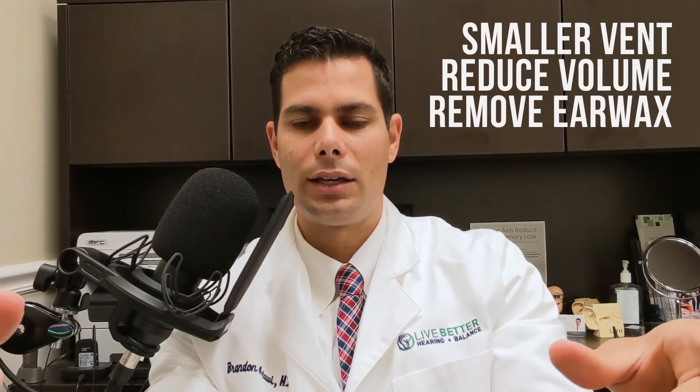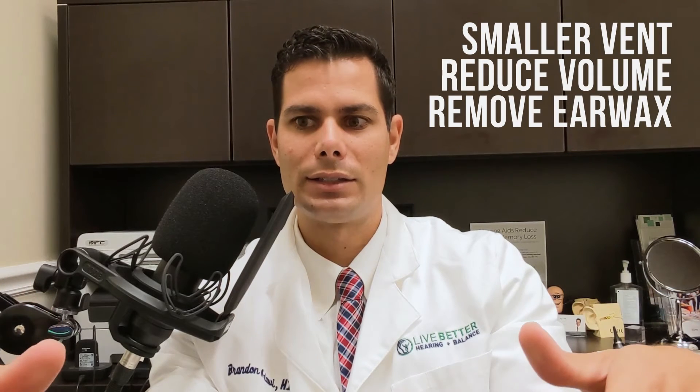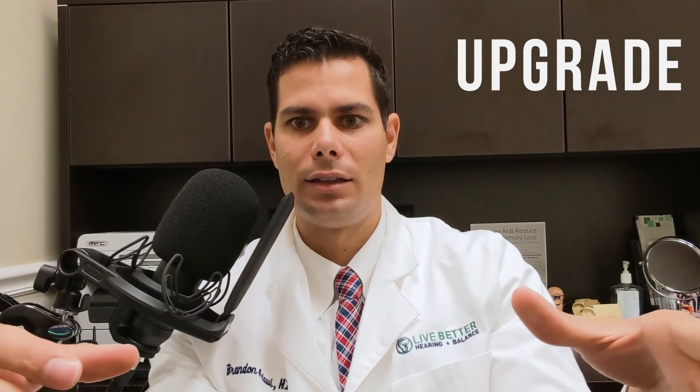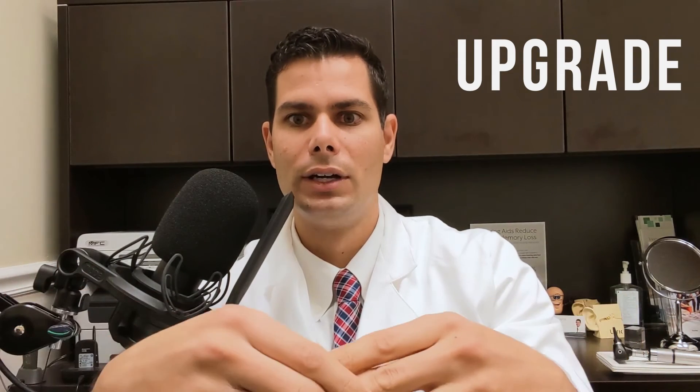So feedback can be reduced by shrinking the size of the venting, by reducing the volume, and by taking out earwax. Finally, it can be reduced by having a hearing aid that has feedback suppression. The faster the hearing aid is at reducing that feedback, the better it is at preventing feedback, and it can also allow for more of an open fit. Some modern hearing aids can surprisingly reduce feedback with a more open, more natural fitting hearing aid, so maybe upgrading your hearing aids is the solution.